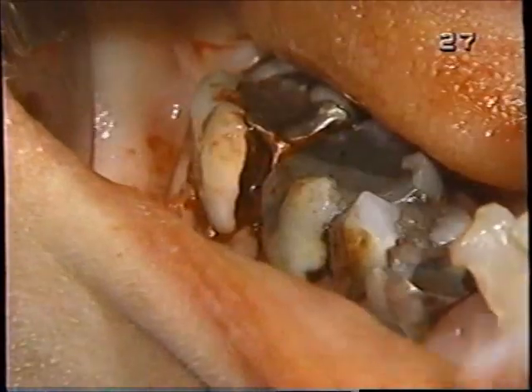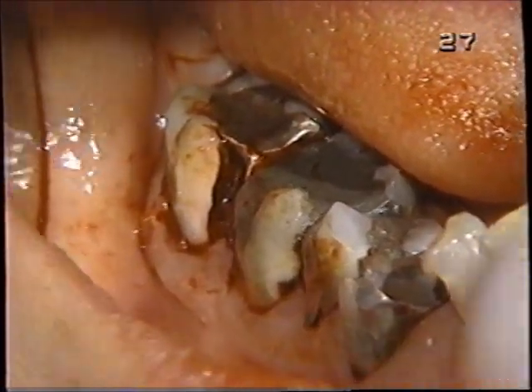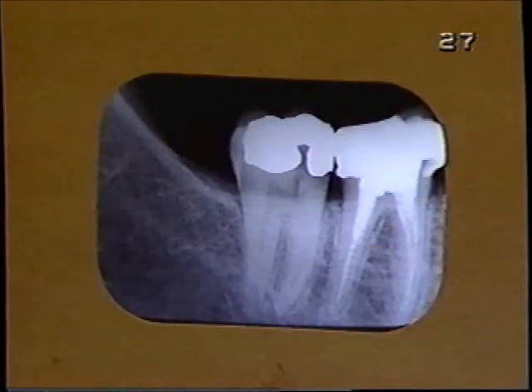Let's go ahead now with forceps. What I'm going to use is the 23, which is the cow horn. And the roots are pretty straight.